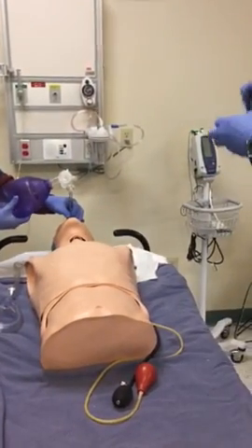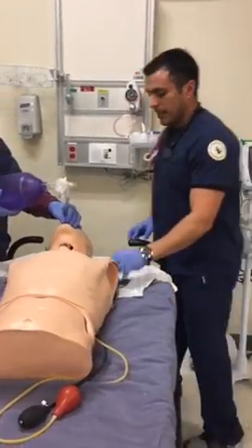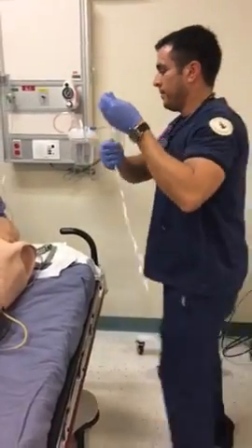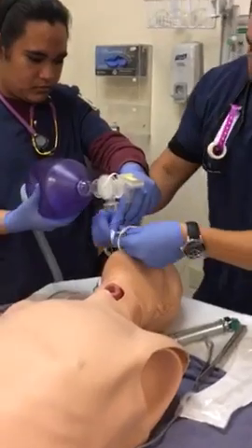Once that is done, and once we're sure that we're in the airway, what we're going to be doing is securing the tube. So I'm going to be using a tie. Can you come up for me, please? Thank you.